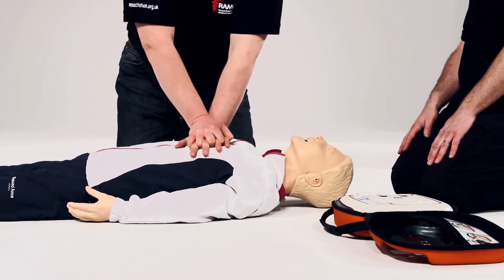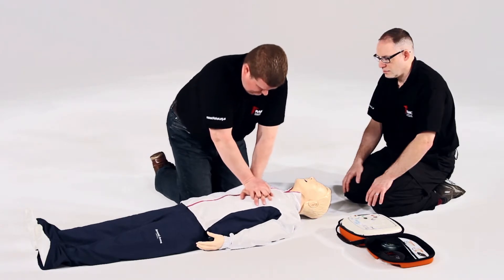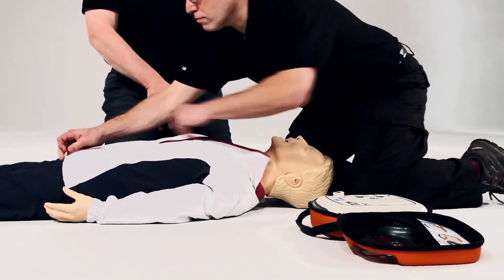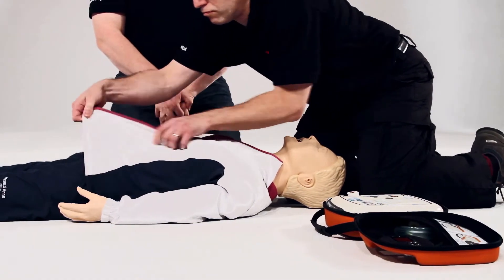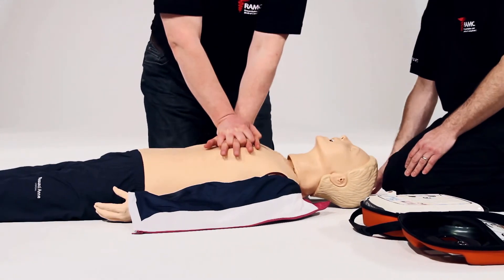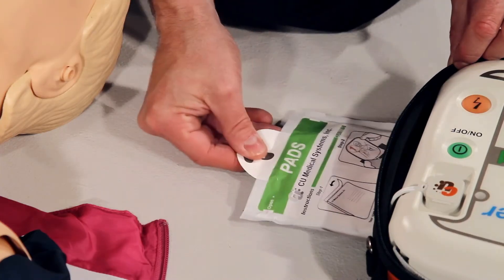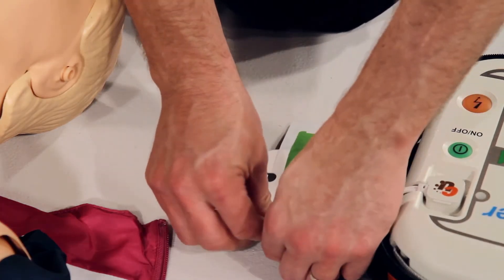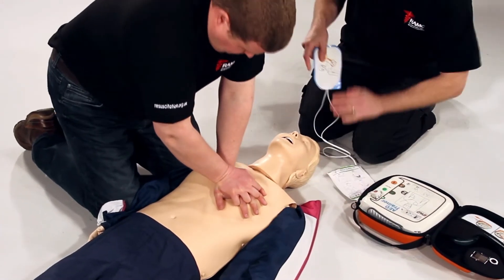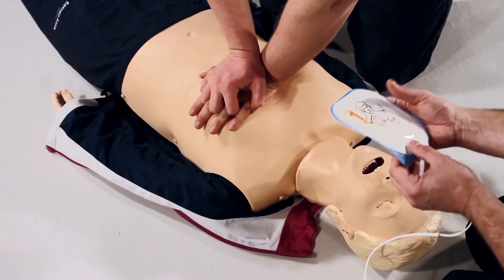Follow the voice prompts calmly. Remove all clothing from the chest and stomach — rip clothing if necessary — to expose the casualty's bare chest. Tear open the pads packaging and remove the pads from the AED. Look carefully at the pictures shown on each pad.